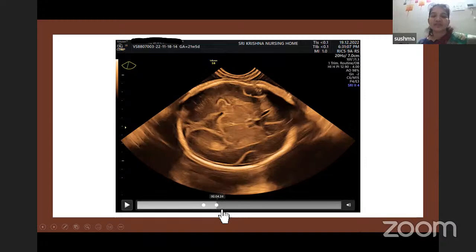Now the next one, here we got axial sections. This is arrow sign, that is transthalamic. So as you are noticing, in all the sections, we have to focus if CSP is present. This is a rectangular box-like structure which is longer than wider. CSP ratio also we take, that is the length to width ratio. Length always should be longer than the width.